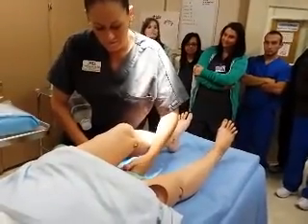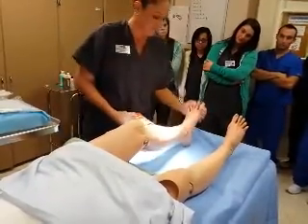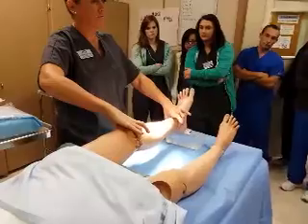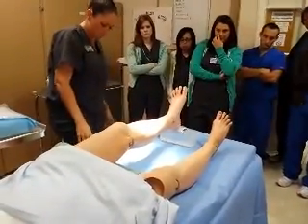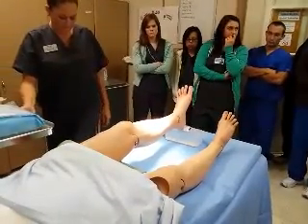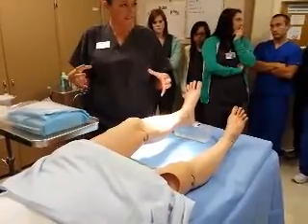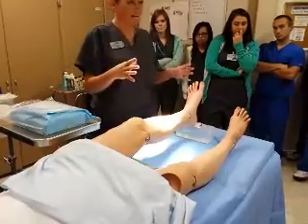I'm going to go under the knee because I'm back behind the joint. I'm going to go up here by the foot because then that exposes this. This is what I need to prep right here. So I put my kick bucket close. I like to keep my area close and tight. That way I don't have to do much of this motion and accidentally turn my back.